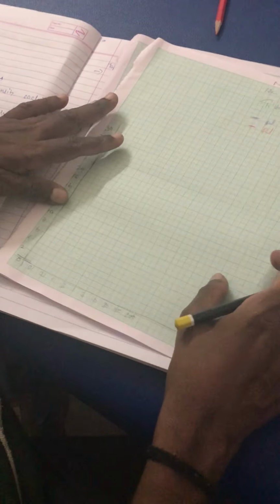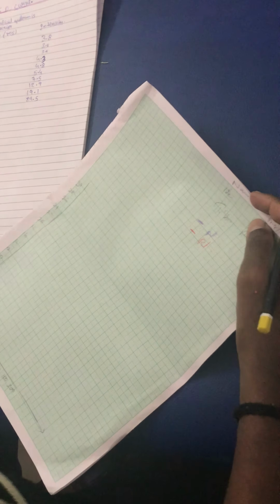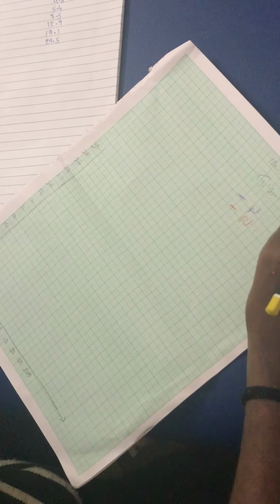Okay, pencil. Right now everything is computerized. Have you seen that machine which I asked you to see there? No, not that one. The other one. What happened? Okay, have you? No, not seen. Okay, fine, not seen.